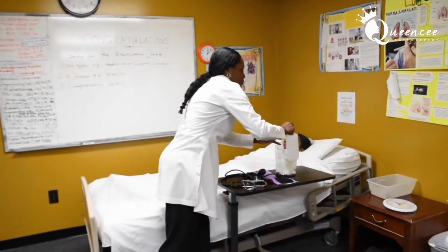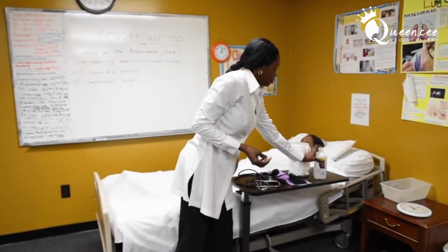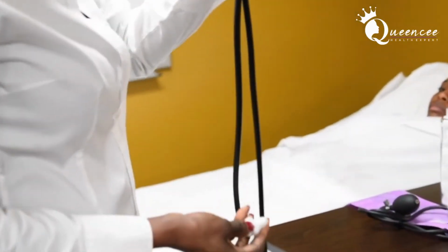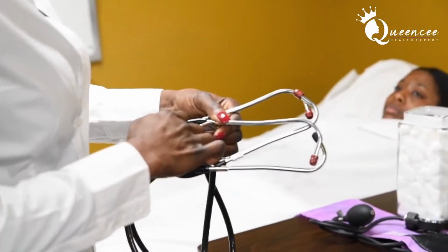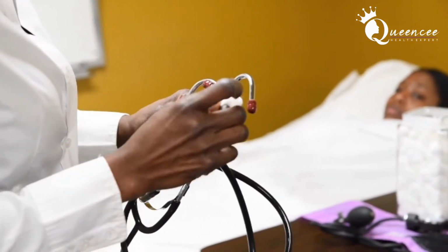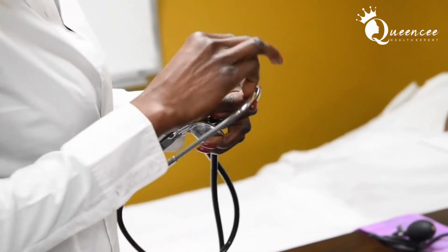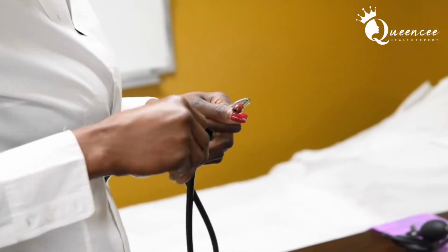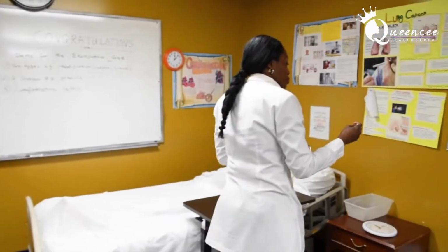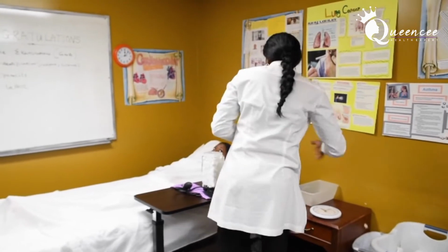Now I'm going to pretend I'm you. Like we said, you will not be speaking. You just come here, the examiner is up, you disinfect the diaphragm of your stethoscope, then you disinfect the 2 earpieces for you and the examiner. When you get your alcohol, try your best not to soak the cotton ball with too much alcohol. If that's the case, then I would advise you to squeeze it out, or else your ears may start getting irritated.